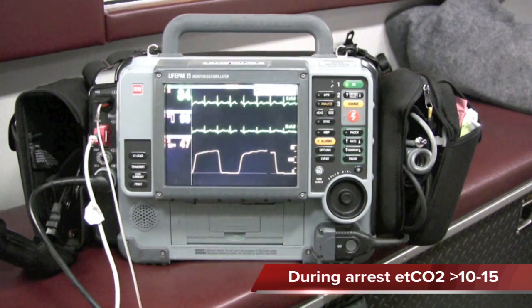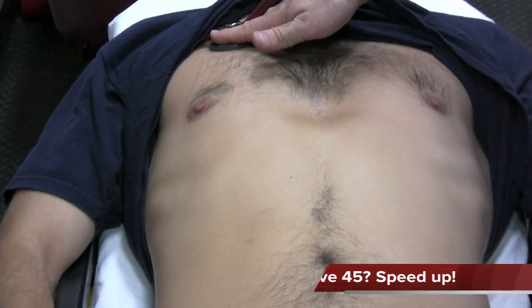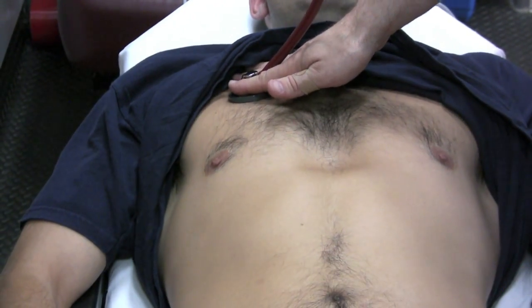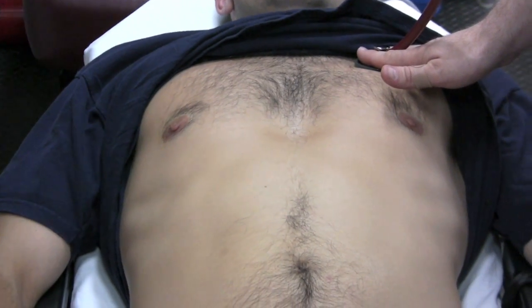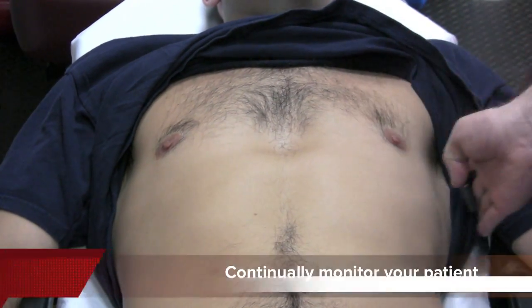If the patient's CO2 reading is above 45, you're ventilating too slowly. If, as is more common, your end-tidal CO2 reading is below 35 or below 10 in cardiac arrest, the most common cause is that you're ventilating too quickly. Slow down. Now, confirm airway placement and, of course, continually monitor your patient.